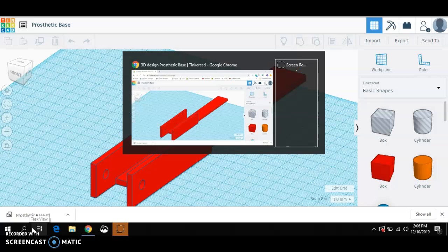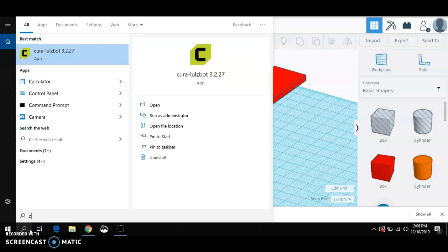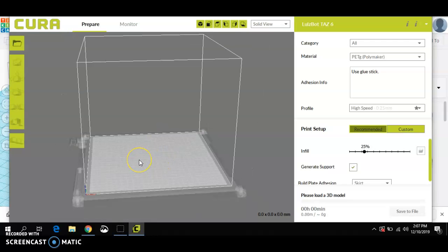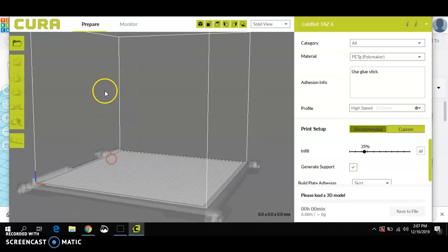Now, I'm waiting here. I don't see Cura opening, so I'm just going to try again. I may have missed something there. Oh, and here it is. So this Cura is 3D slicing software, and it develops something called G-code that tells the printer exactly how to print.